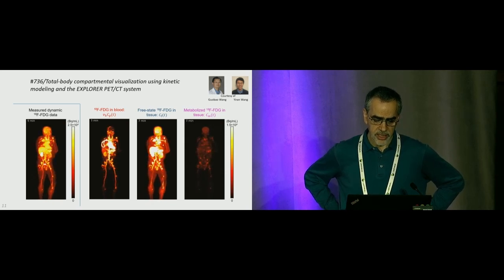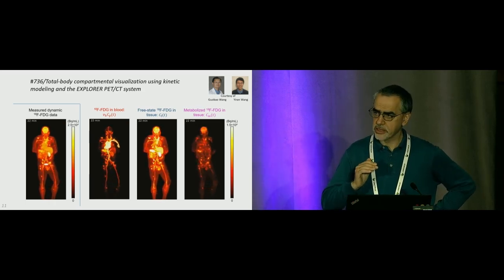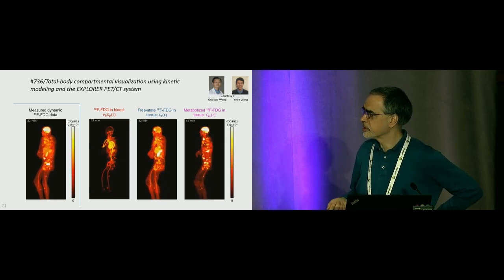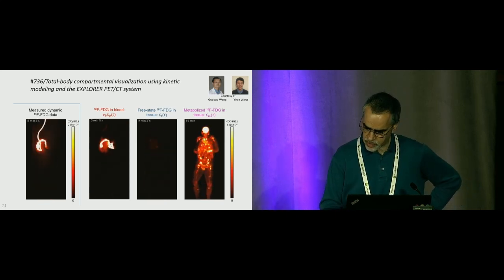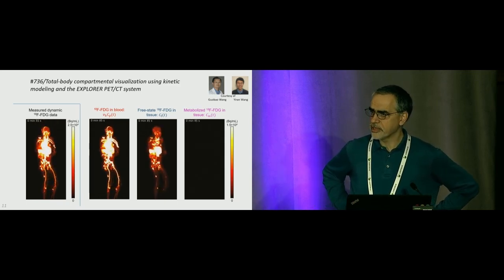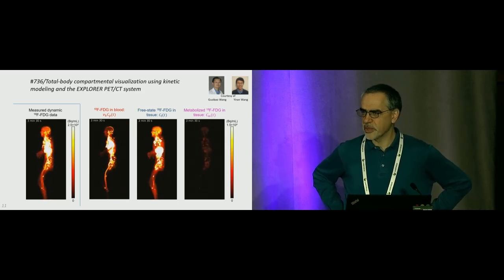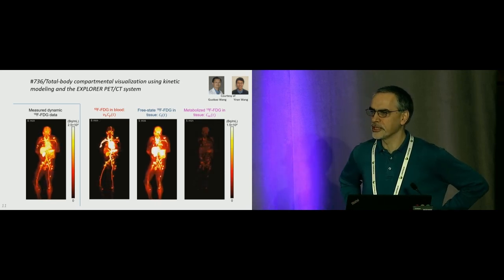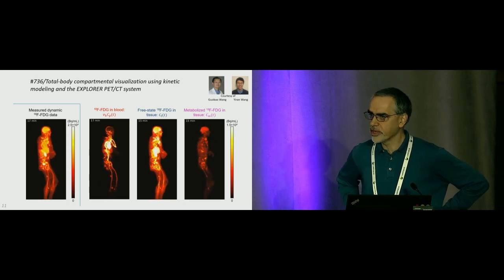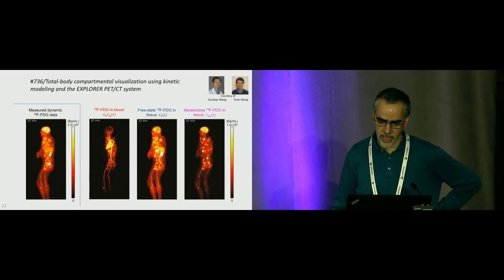The third image there is FDG that has gone from the blood into the tissue but has not been metabolized. And then the fourth image, the image on the right, that shows the FDG getting metabolized in the tissue. So I'm going to show that movie one more time so you can get some idea about it. You can see how you're getting different information of the FDG in the different compartments. This isn't something that's sort of been done before. I'm not 100% sure what it's useful for yet. We kind of think it's really cool, at least. But we're hopeful that in the future we'll find applications for this kind of technique, which, again, is totally impossible unless you've got total body PET.